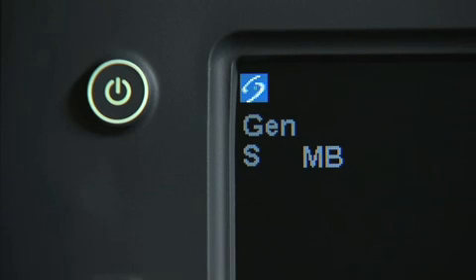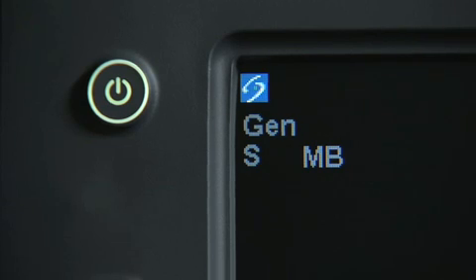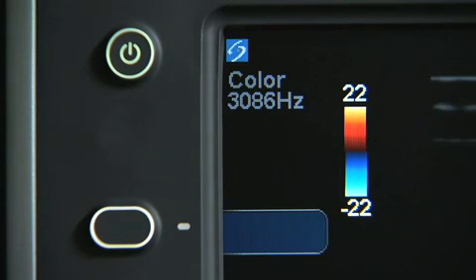The mode data is displayed at the top left of the screen. Current image mode information, such as GEN, RES, PEN, SONO HD, or SONO MB, will be displayed here. When color doppler or color power doppler is active, the pulse repetition frequency will be displayed.